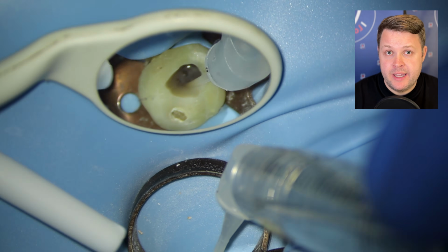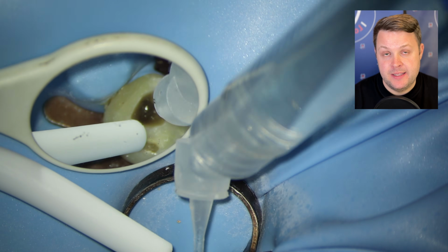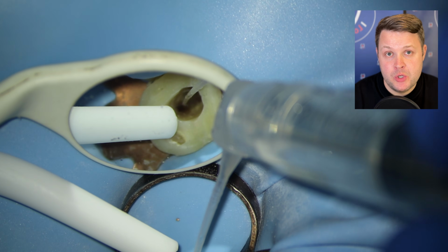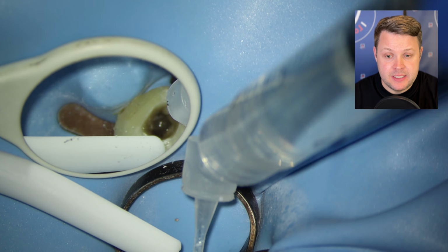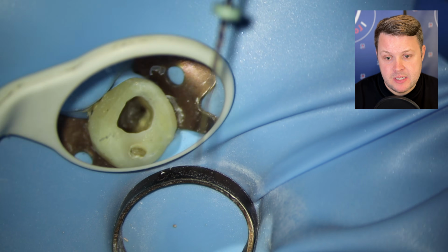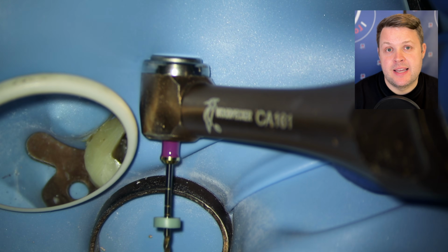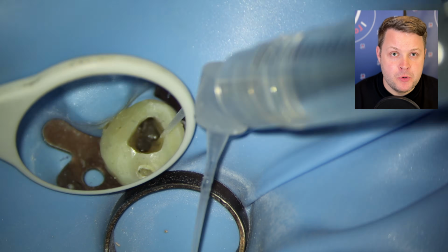So we know we can't get to the end of the palatal, and what I did notice is, as I was irrigating and shaping these 3 canals, we've noticed there's an MB2 orifice. It's obvious and quite wide, so rather than negotiating with some hand files, I'm going to take a size 10 glide path file down this canal orifice. I'm not going to push it too far down, I'm just trying to open up this canal space, and I'm also going to use a size 20 as well. Again, I'm not going to push it too far, I'm just opening up this orifice.